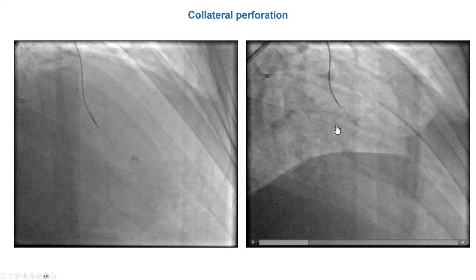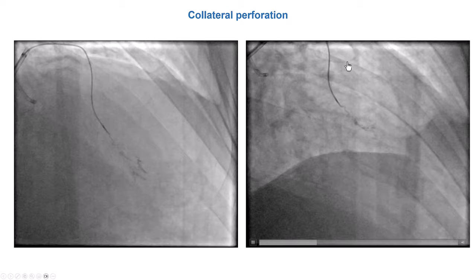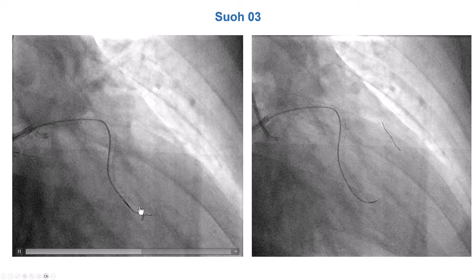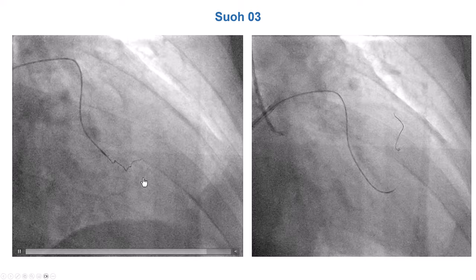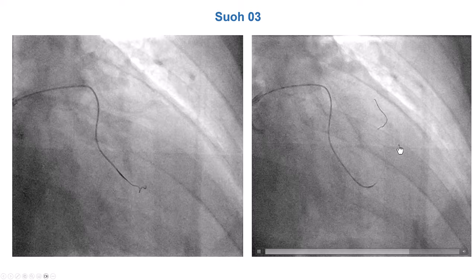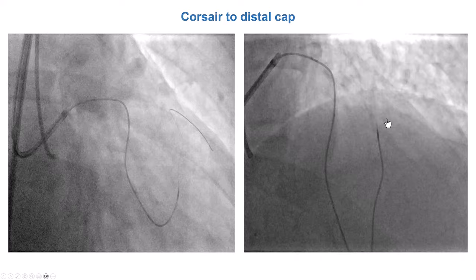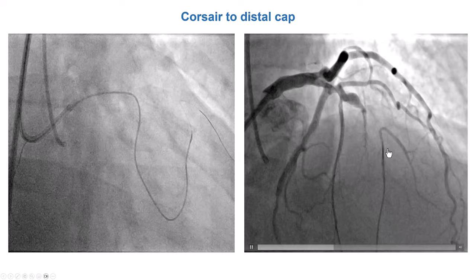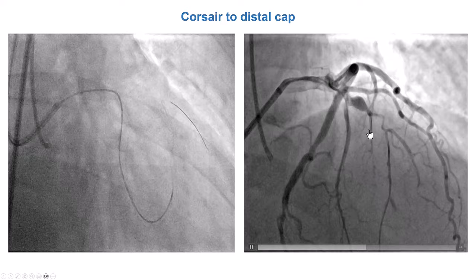The question at this point was whether to continue or abandon the ipsilateral retrograde attempt and try antegrade. We decided to give it another try. We went back with a SUO-03, which is soft and less traumatic, using gentle rotation. Then, following the breathing and movement of the guidewire along the area of tortuosity, the wire seemed to advance along the course of the collateral vessel going towards the LAD. This was confirmed — we were in the LAD — and we were able to advance the Corsair microcatheter. We now had the Corsair into the septal close to the distal cap, a very powerful position for our retrograde crossing.